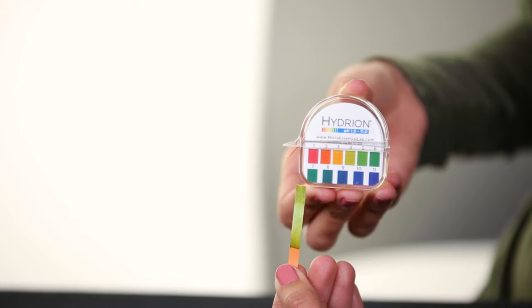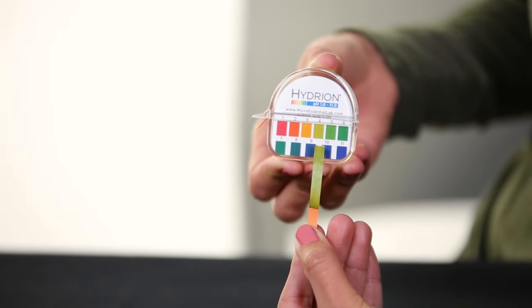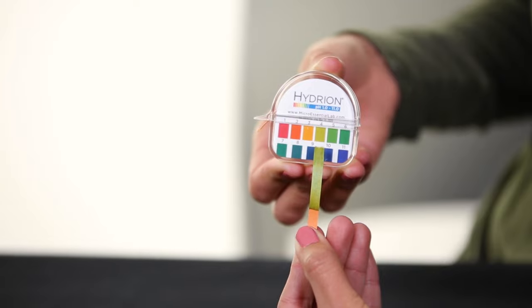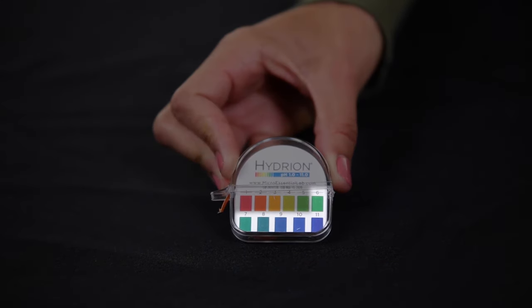Push some of the stomach contents on the pH paper and watch it change colors. If the color on the pH paper matches a color showing one to five, the tube is likely in the stomach.